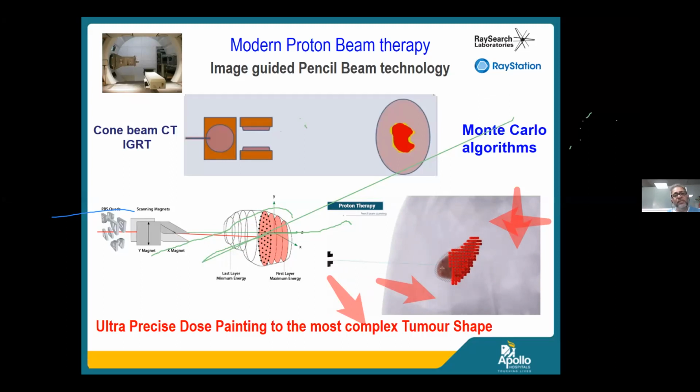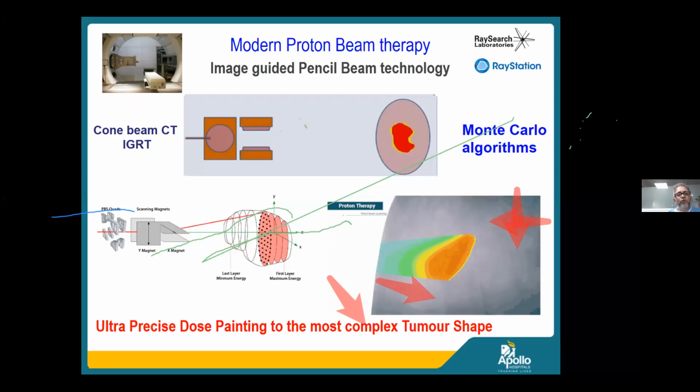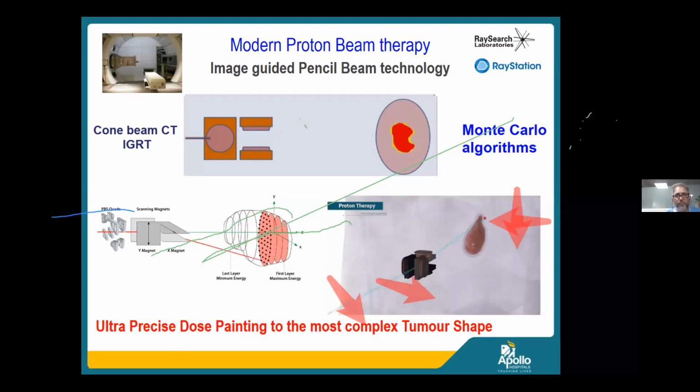So nowadays, every single modern proton beam therapy has an inbuilt cone beam CT, a three-dimensional picture can be made, and what we call image guidance, which is actually fundamental in any modern photon beam, X-ray, which is the conventional linear accelerator, has been brought.